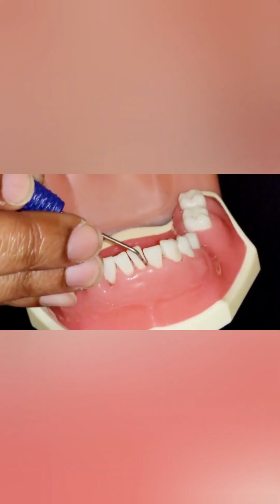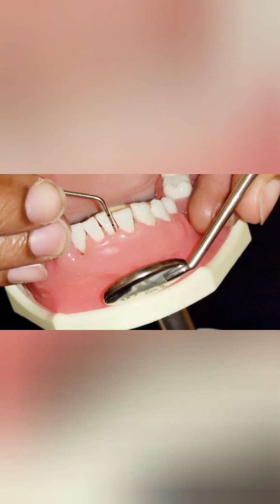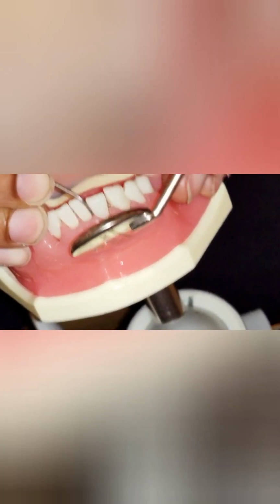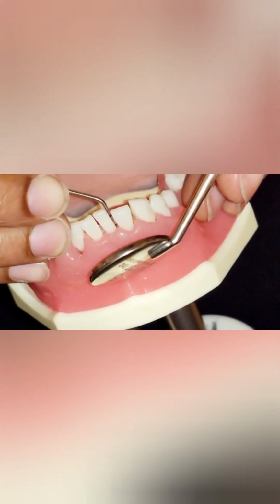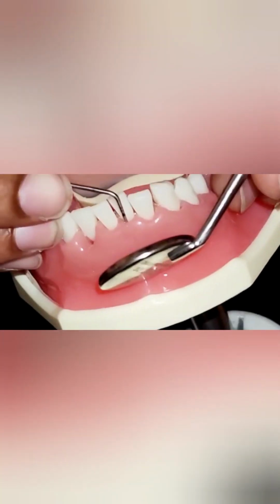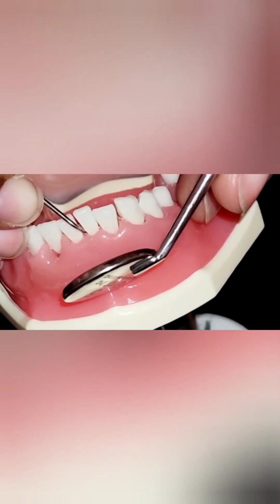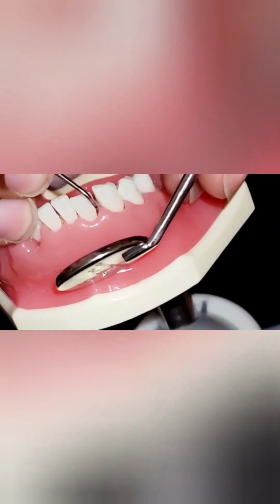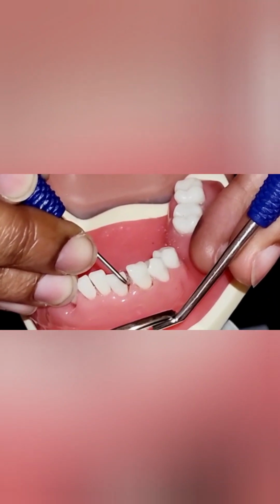And of course, let's use the mirror to get a better idea of what our numbers are. We have a 9. Nine and an 11. We have a 10.